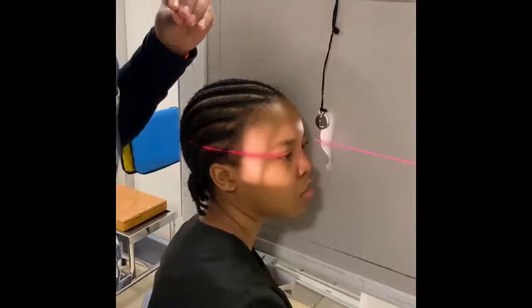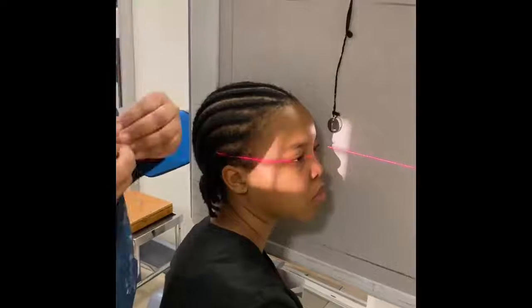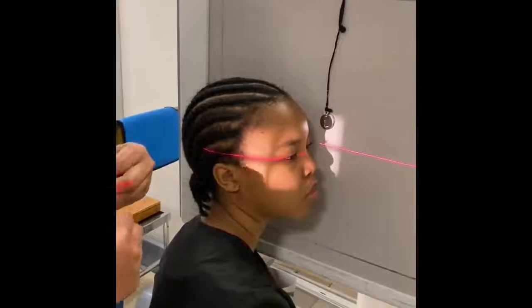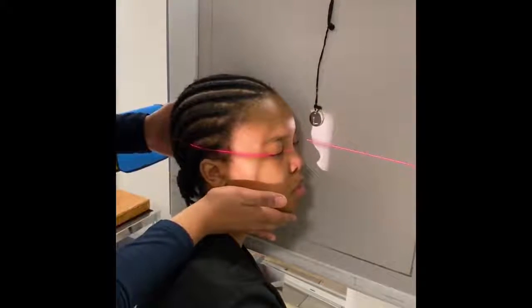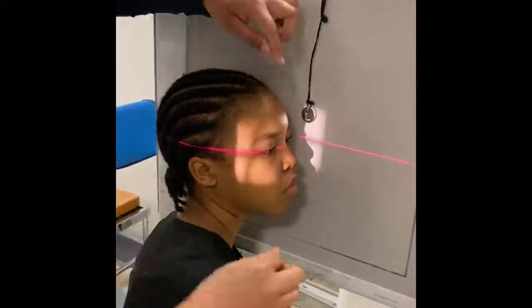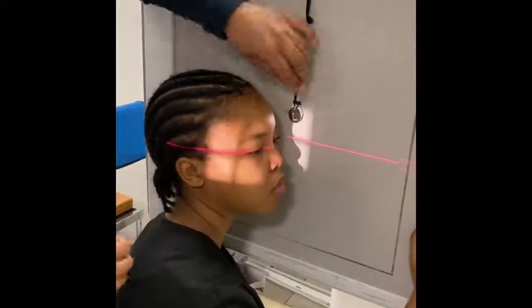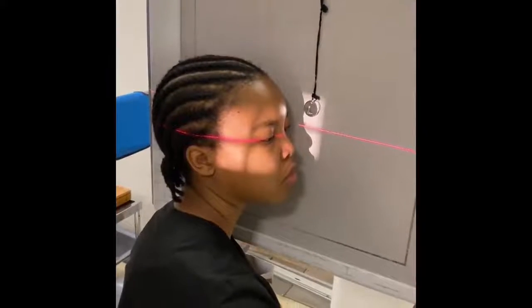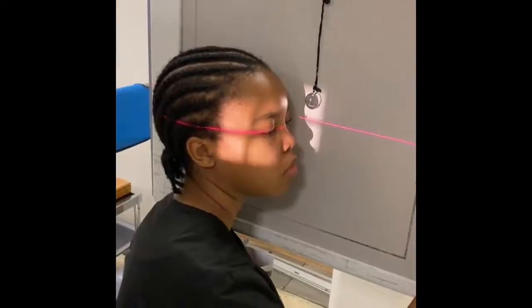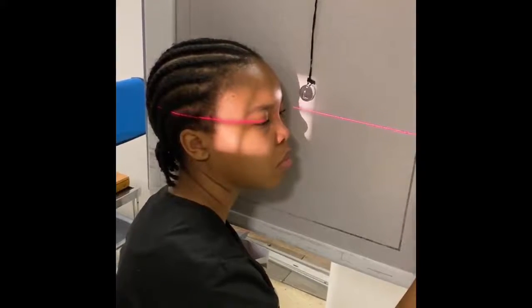The whole idea basically of nasal bones is just to get good collimation and then to give the correct exposure factors. In terms of your centering, I would say that you would center just at the outer canthus of the eye, at the level 1.25 centimeters just below your nasion area. And then you place your marker readable on the side that you are demonstrating, which is our left side. And then it's very important that we collimate so that we get a good image. So that is more or less our four-sided collimation for this patient.